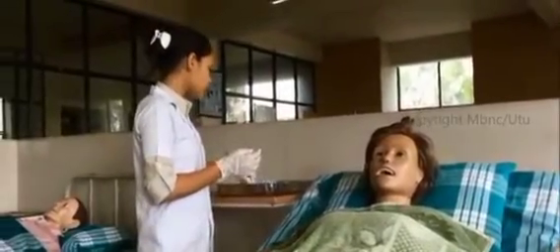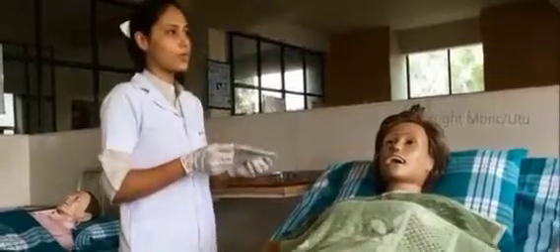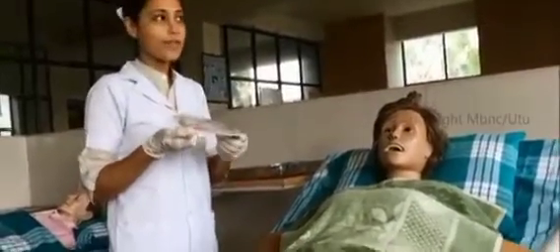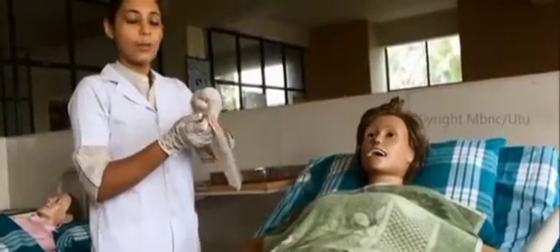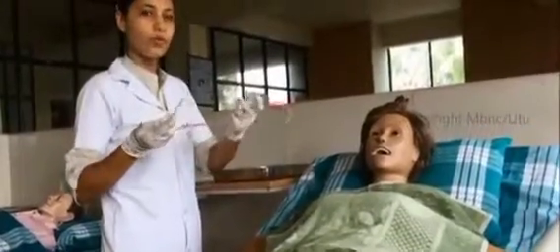So before the NG tube insertion, this is a package of NG tube and it is sterile. While we are opening, we have to be careful, because it is sterile and it will go inside the body. So we have to open it carefully. Then we have to take the NG tube in the hand, and in a rotating manner we have to hold it. Before inserting the NG tube, we have to measure how much of the NG tube we have to insert inside.